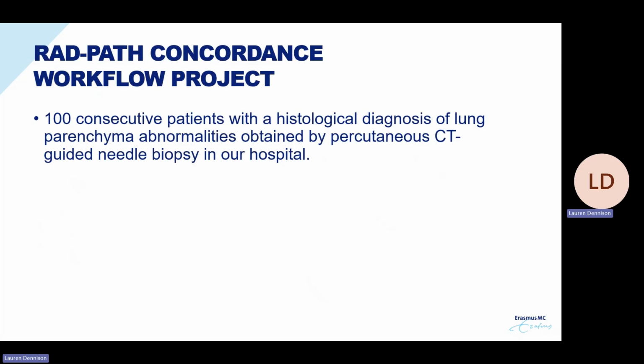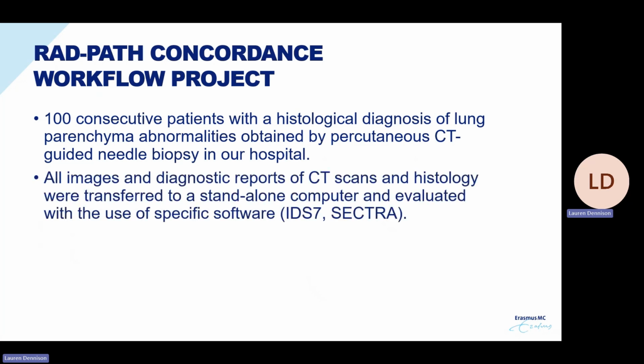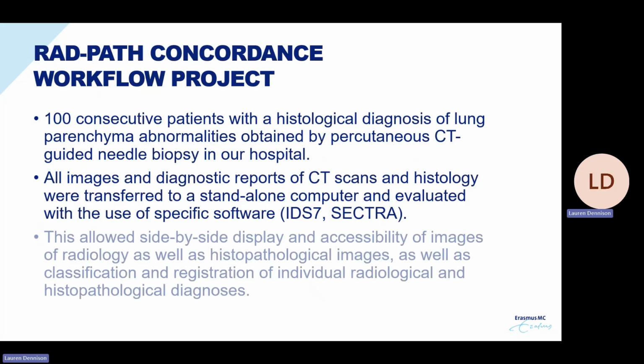So we started a concordance workflow project. We had 100 consecutive patients with a histological biopsy diagnosis of lung abnormalities obtained by CT-guided needle biopsies in our hospital. All of the images and diagnostic reports were available. All the scans and histology scans were available, and they were fed into a standalone system on a computer and actually in the IDS-7 system provided by Sectra.